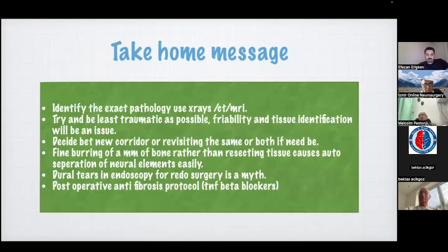So what is the take-home message, gentlemen? Identify the exact pathology. Use all modalities. Try and be as least traumatic as possible, with friability and tissue identification. You feel, oh my God, this is dura. No, this is synovium. You have to identify the tissue. So you have to be comfortable with tissue identification.